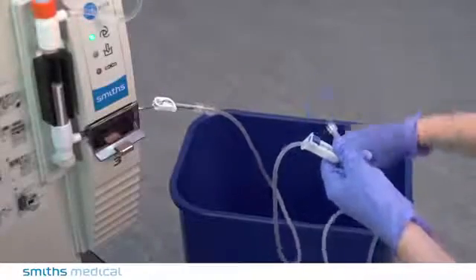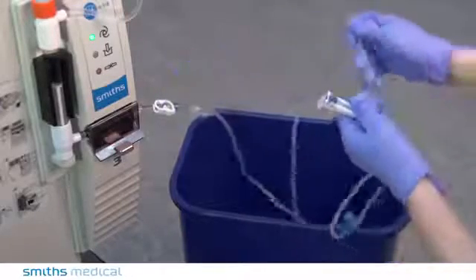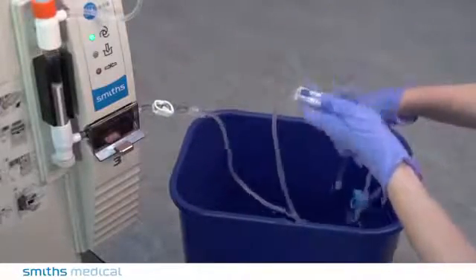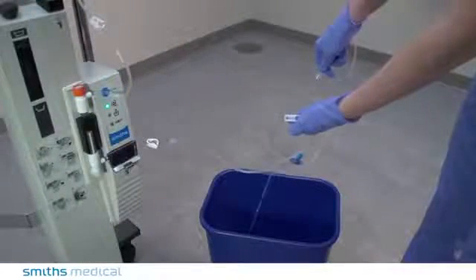Remove the lure cap from the distal end of the patient line. Open the lower pinch clamp and roller clamp. Allow the fluid to flow until no air is observed in the patient line.